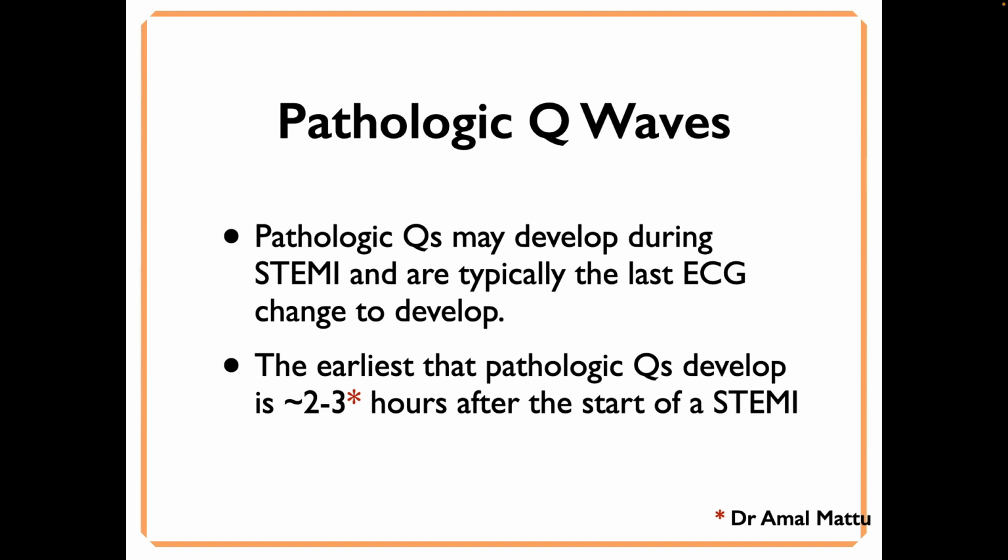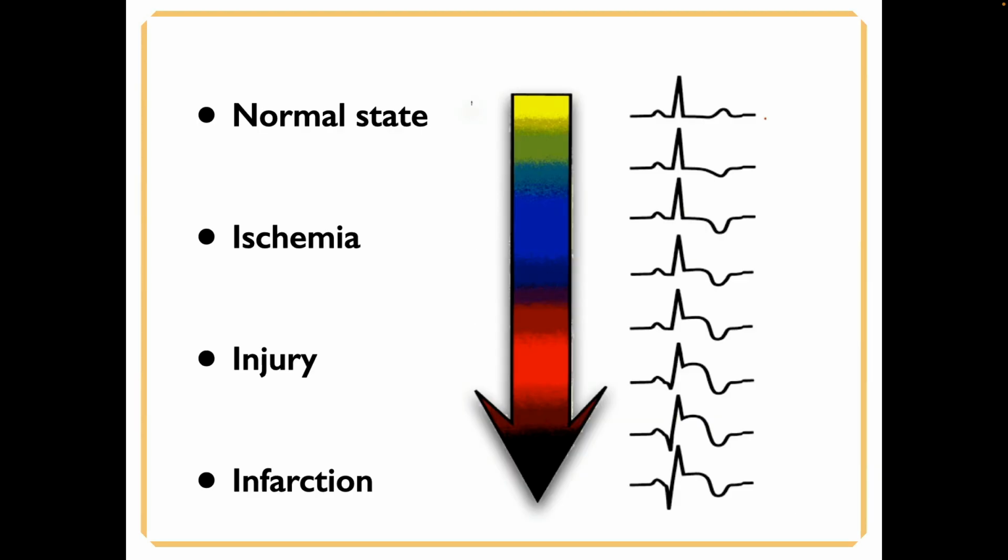A lot of times you'll read 4 to 6, but the expert that I use as our reference in this class is a guy named Dr. Amal Mattu, and we'll be seeing a lot of his videos in the future. So not all STEMIs develop like this, but this is a possible development.